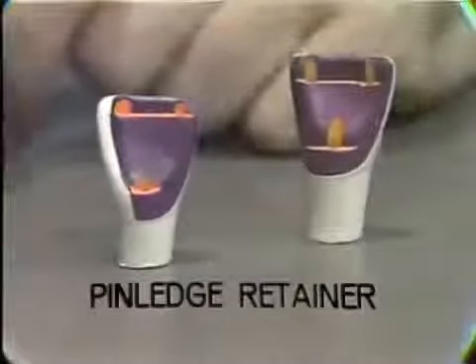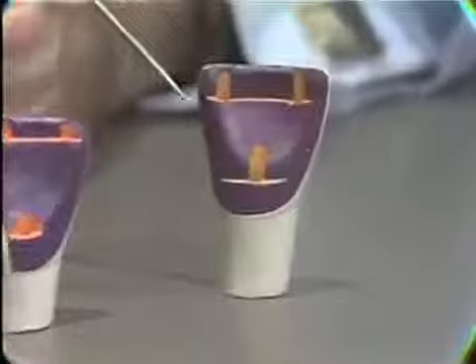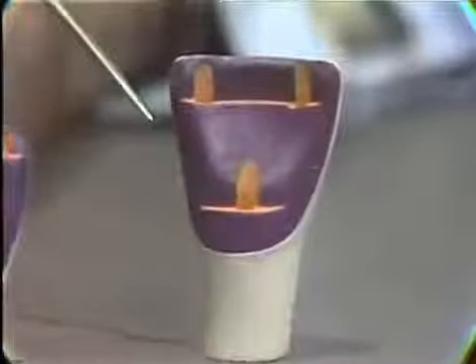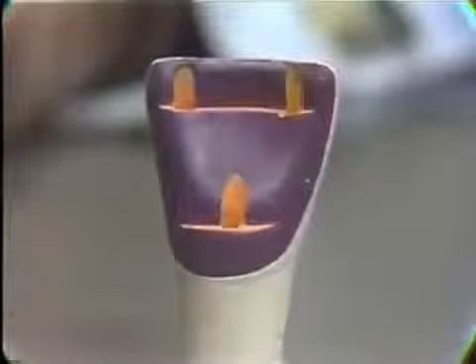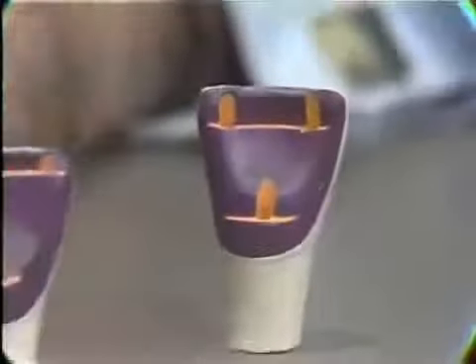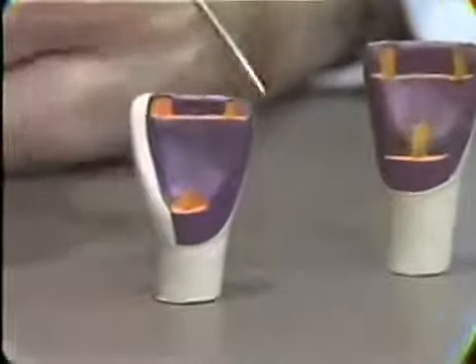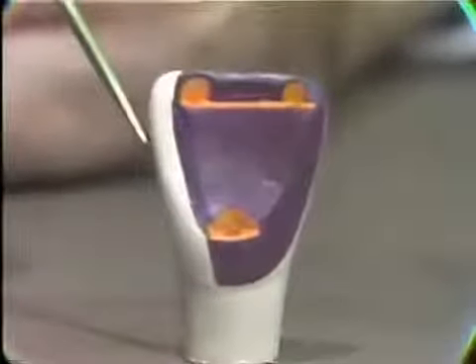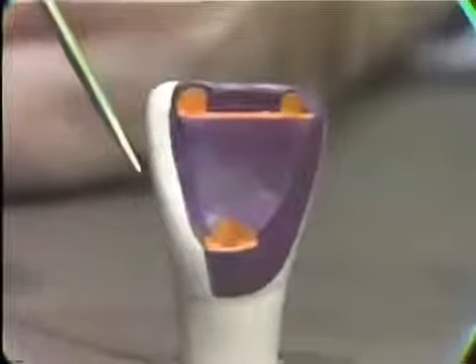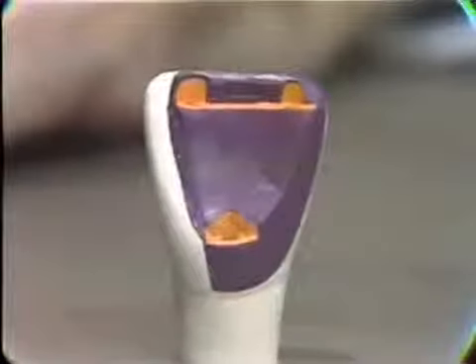On the one on the right-hand side of the screen, this one here is the so-called bilateral pin ledge, in which there is a slice on either side of the maxillary incisor, which this is, with three pins giving retention on the lingual surface. And over here on the left-hand side of the screen is the other variation of this, the unilateral pin ledge, in which only one side of the tooth is sliced. This has the advantage that it's not necessary to get involved in the contact situation on this side, and essentially the same amount of retention is gained by the three pins on the lingual surface here.